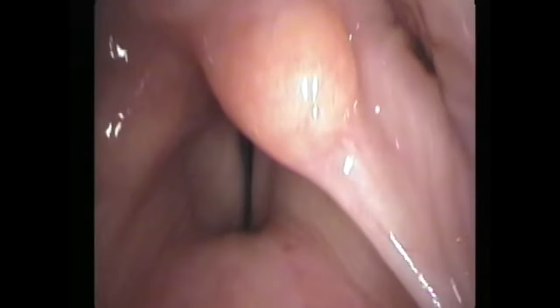I'll briefly touch on one thyroarytenoid muscle finding here on the right - the right vocal cord during stroboscopy tends to oscillate more lateral than the left, so it has less tension and spends a longer period of time in that lateral phase, again suggesting lack of tension within the right thyroarytenoid muscle. Combining the findings on the right of a weak thyroarytenoid muscle and a weak lateral cricoarytenoid muscle, I would say that this recent onset loss of voice is from an anterior branch injury on the right, probably a viral injury, and she can't close the right side, so she's leaking air, making her voice soft.